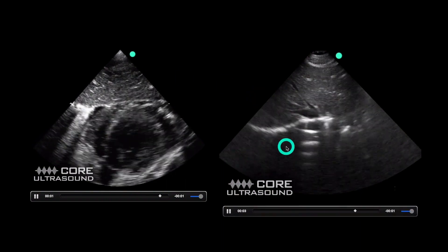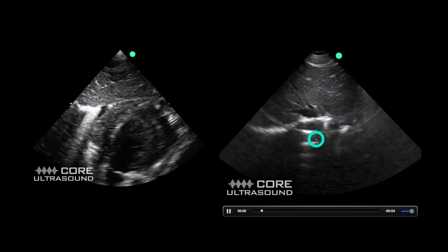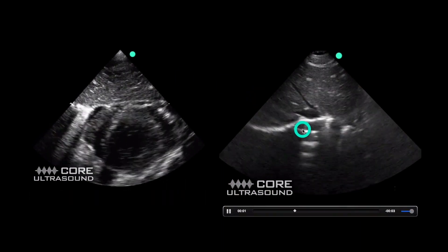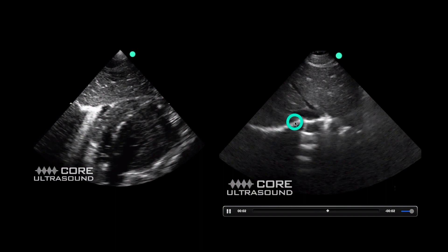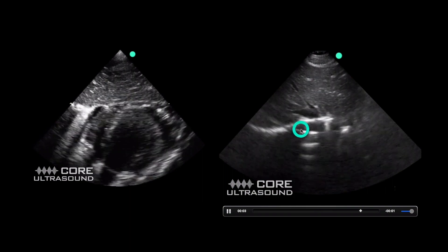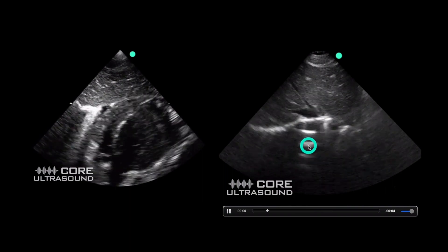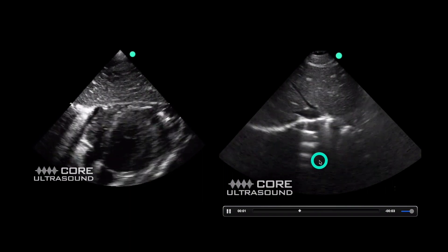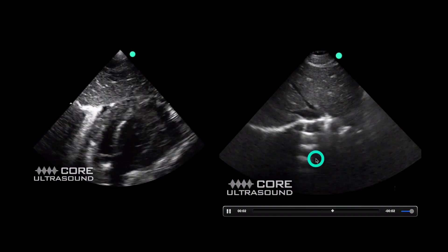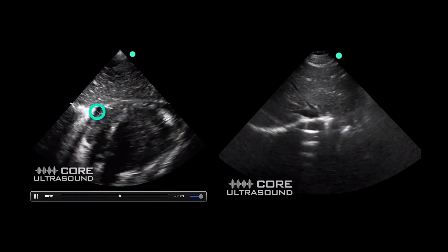This here is pneumomediastinum — you actually can't even see the heart. All you're seeing is a uniform white line with a bunch of A-lines underneath it. Pneumomediastinum and pneumopericardium.